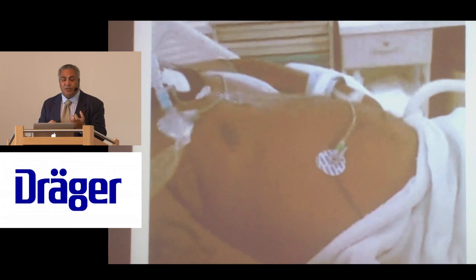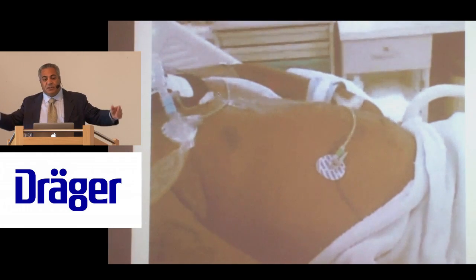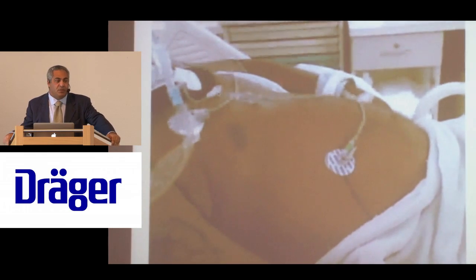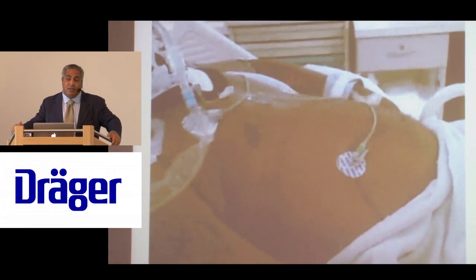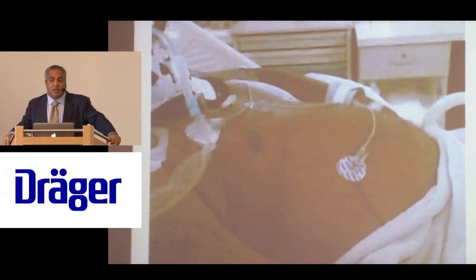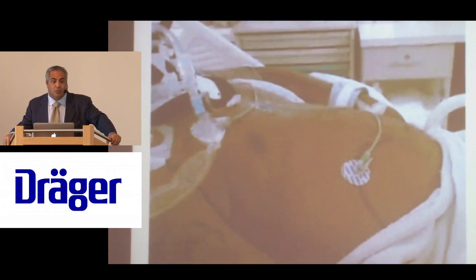You have either flow limitation or your lung is collapsed and not allowing the thoracic cavity to expand. But this is high effort, and the patient will not be comfortable. And of course, you can sedate them, but this type of breathing pattern may not really respond unless you paralyze the patient. Because of course, this is a brainstem effort, not a cortical effort.